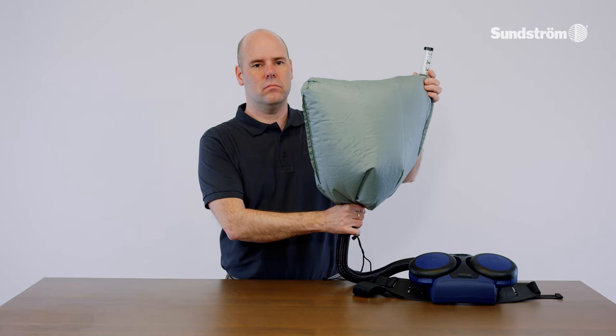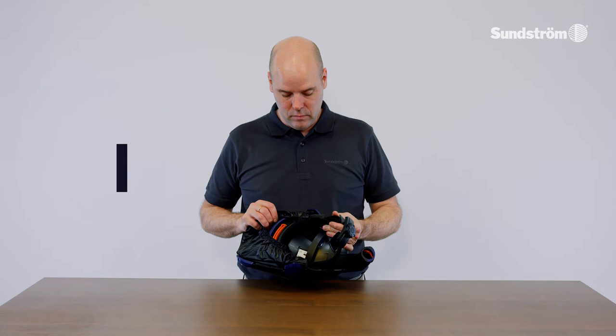If minimum flow is not achieved, check that the flow meter is held upright, the ball moves freely, and the bag seals well around the hose.